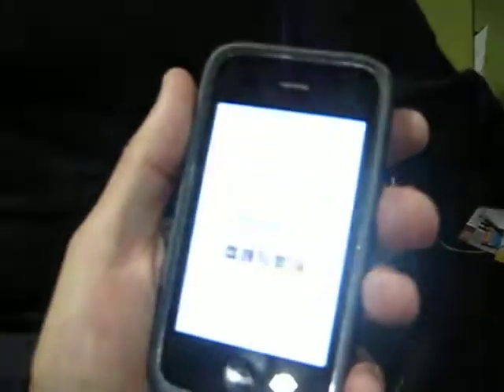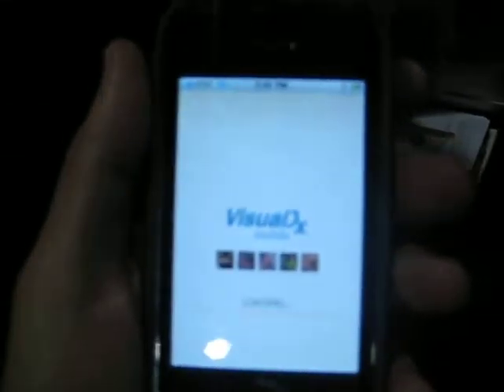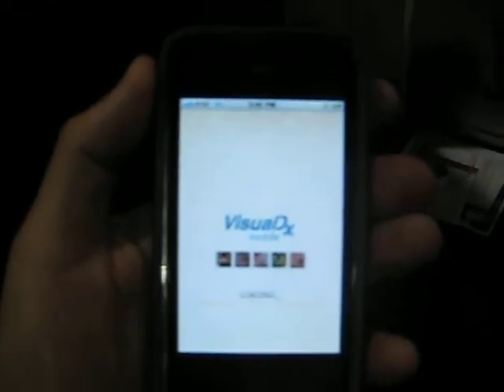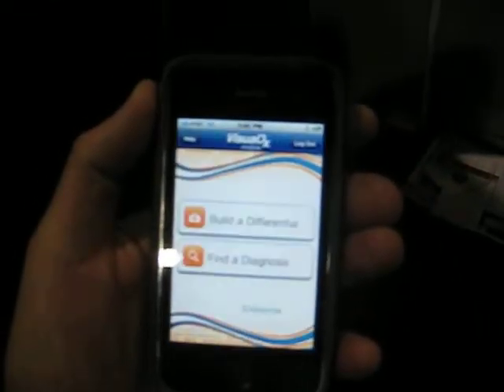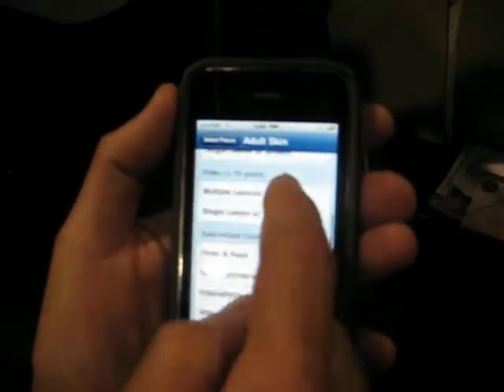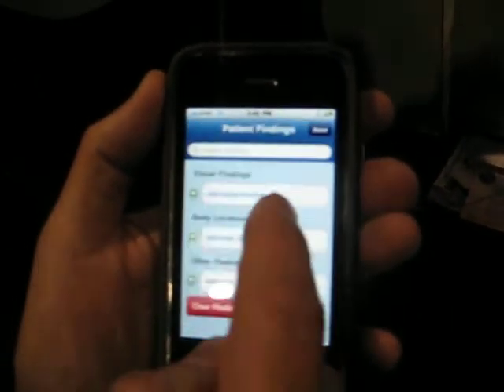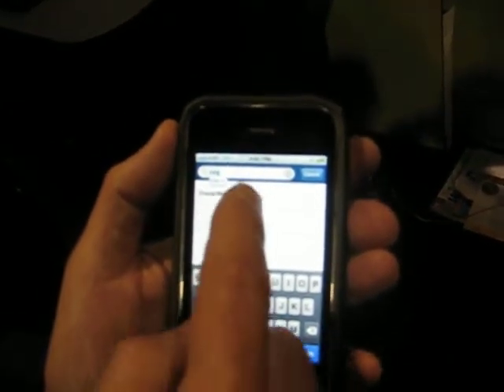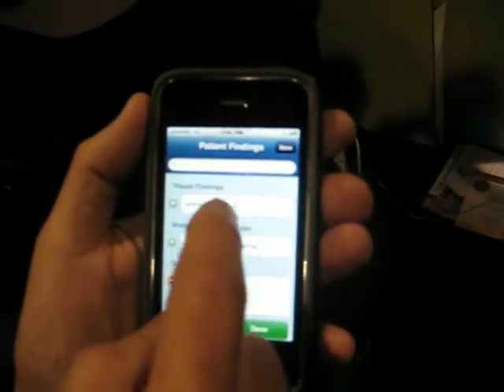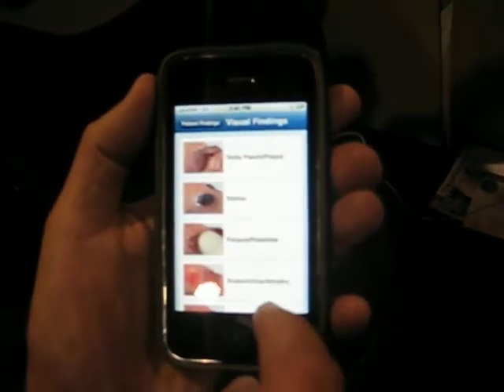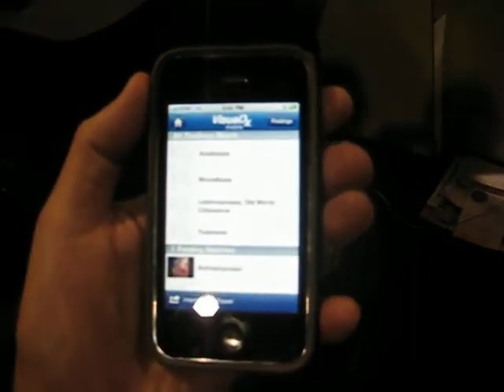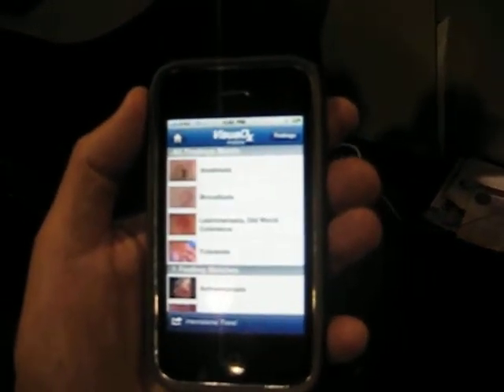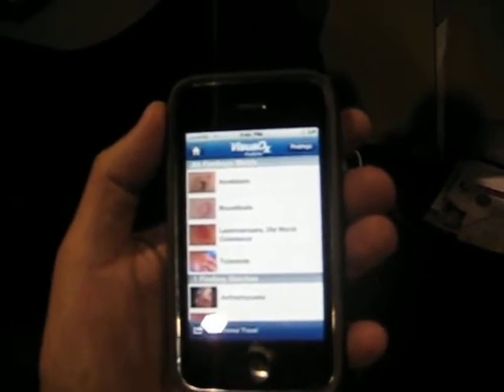Here's the iPhone. We're going to launch the VisualDx mobile application. We're going to build a differential, and we're going to say it's an adult patient that's traveled — I'm choosing international travel. You're going to type in that the patient is a soldier back from Iraq. So I enter Iraq, and then I can enter the visual finding and say that I see an ulcer on the skin. Say done, and then it gives me the differential of an ulcer in a patient that's traveled to Iraq.